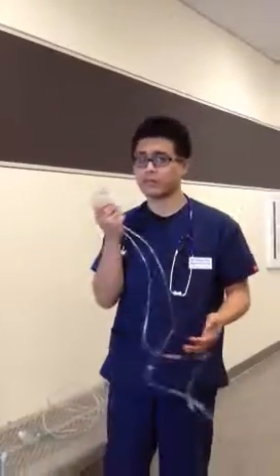They're good. Let's do it. But if it's like 8, 9, 10, that's iffy. That's where you go: I would ask my preceptor what the hospital policy is towards this treatment, because everyone has a different type of humidifier and different type of equipment. But in that, same indications, contraindications, same hazards, just different applications. Okay. So I'm going to go into the partial rebreather.